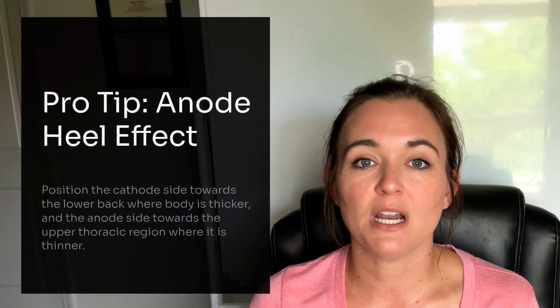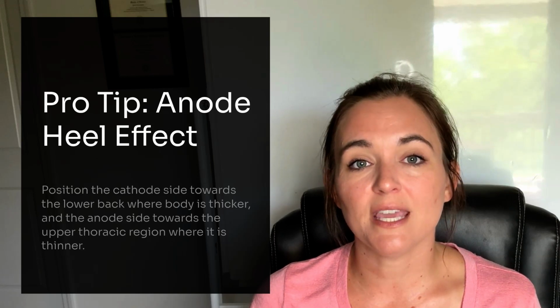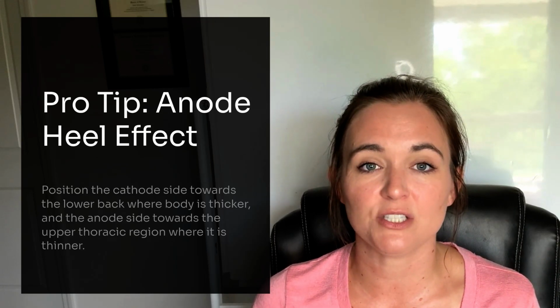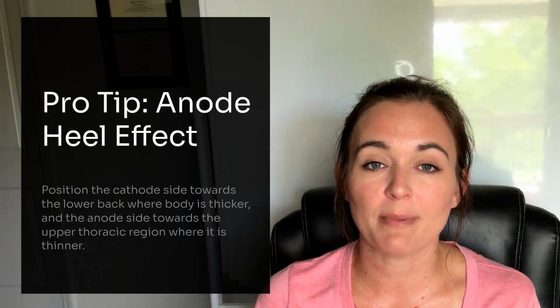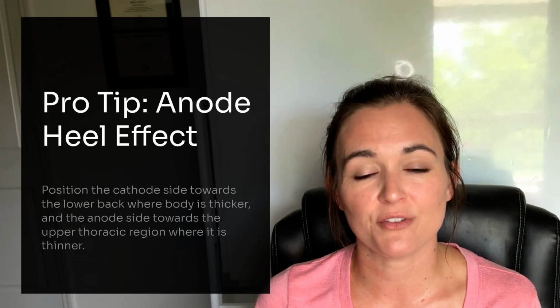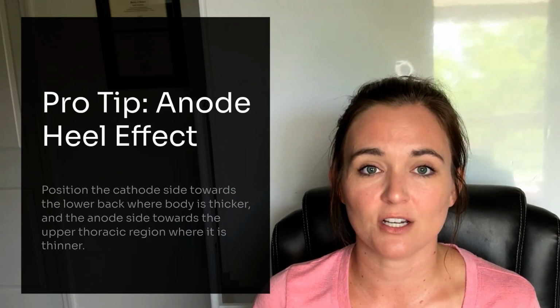Now here's a pro tip that helps with image quality. Use the anode heel effect. That means positioning the cathode side of the X-ray tube toward the patient's lower back, where the body is thicker, and the anode side toward the upper thoracic region, where the body is thinner. This naturally evens out exposure from top to bottom. And if you're working with a fixed table or can't flip the tube, just know you might need to manually adjust your technique or use a wedge filter to avoid blowing out the upper thoracic vertebrae with too much exposure.